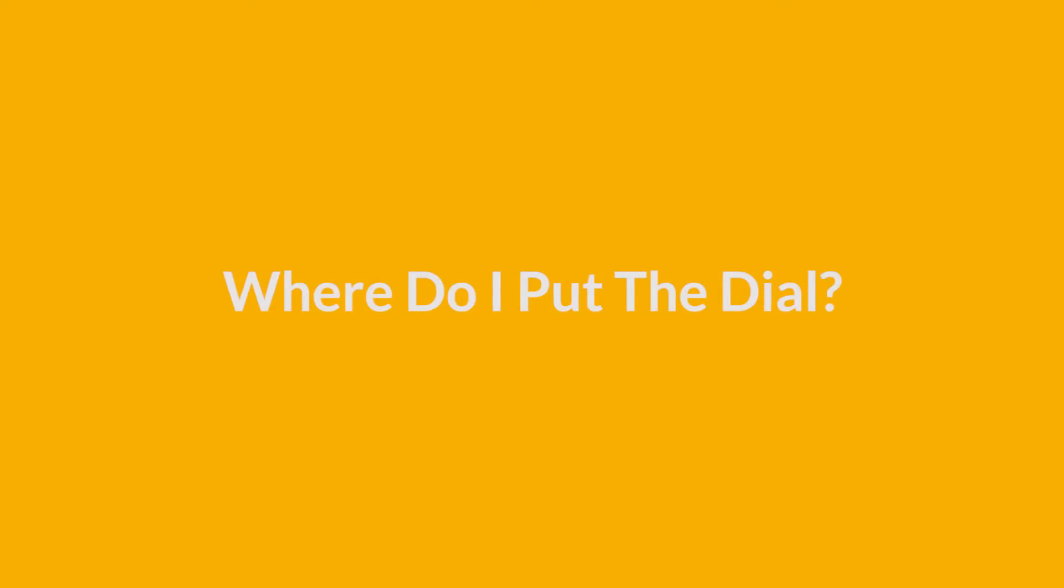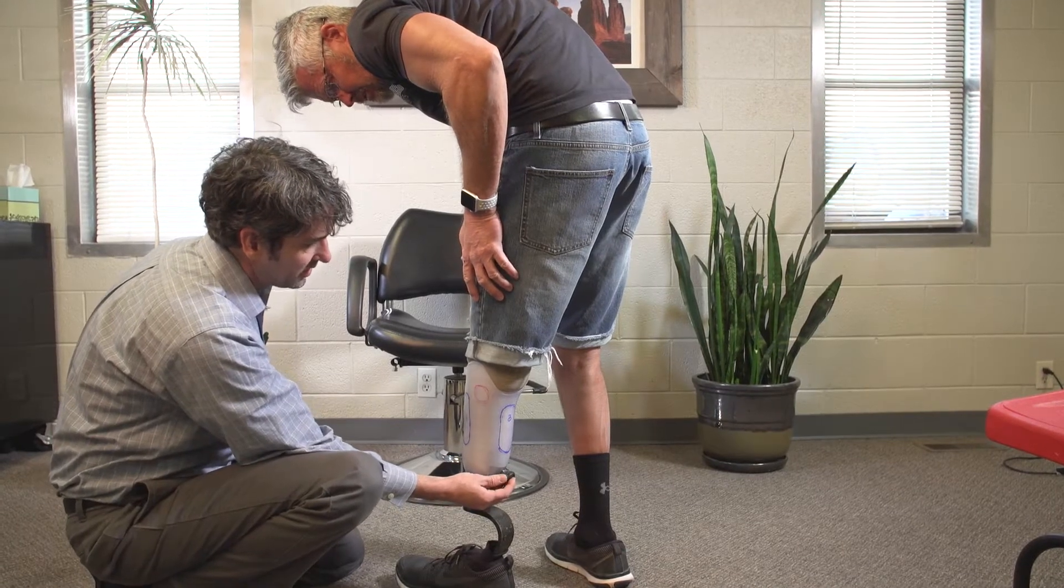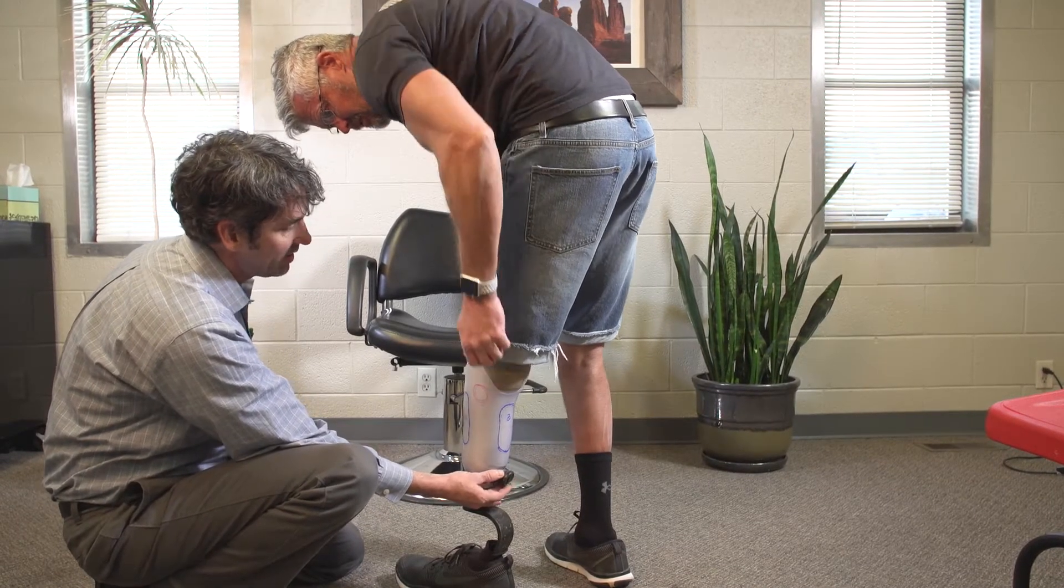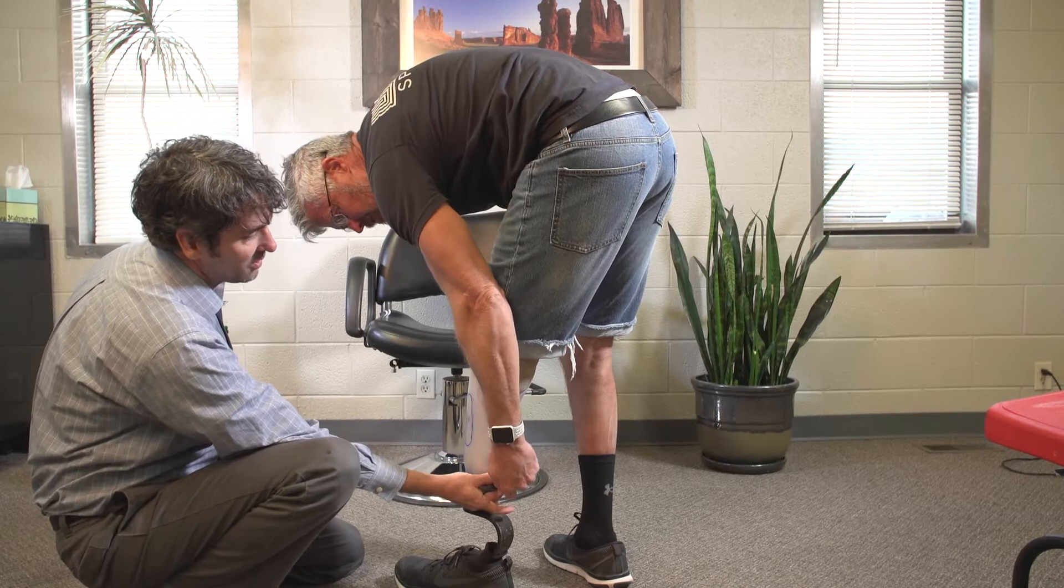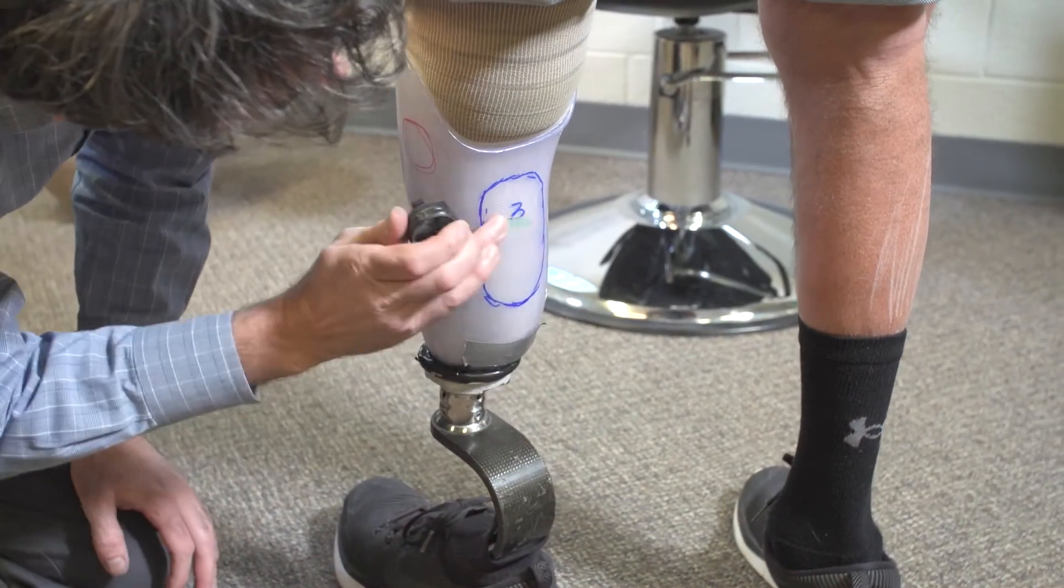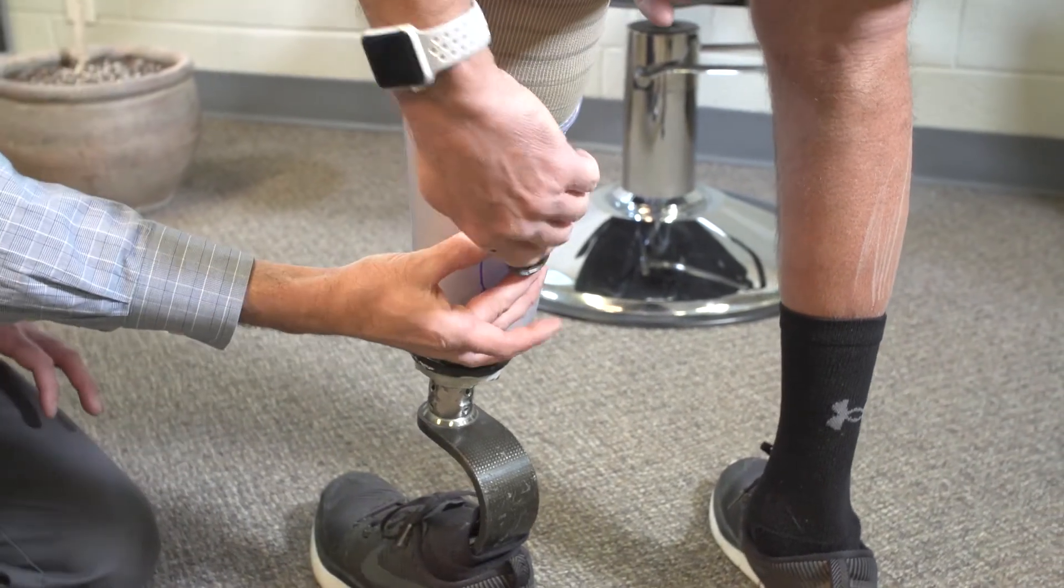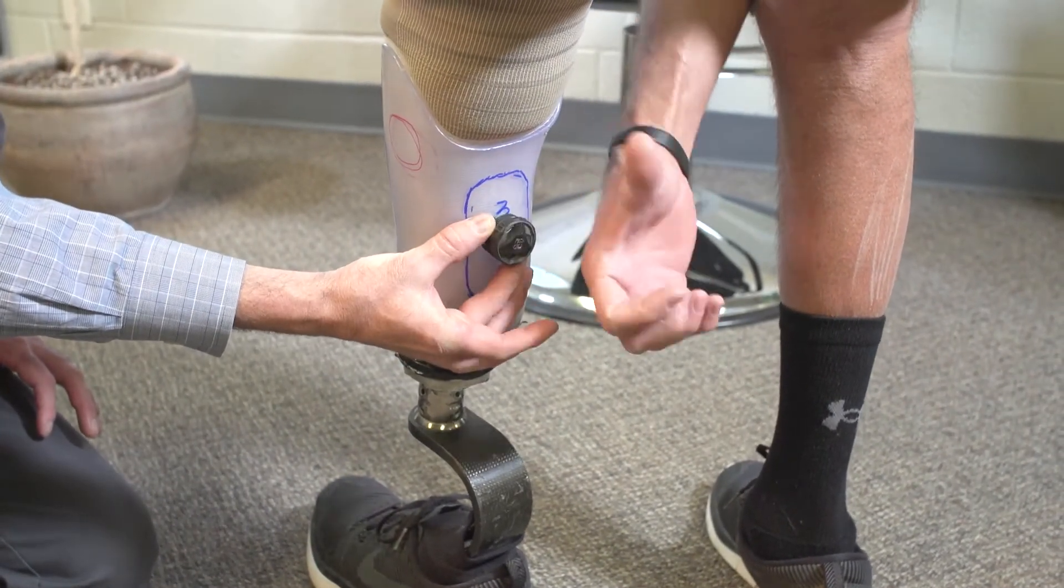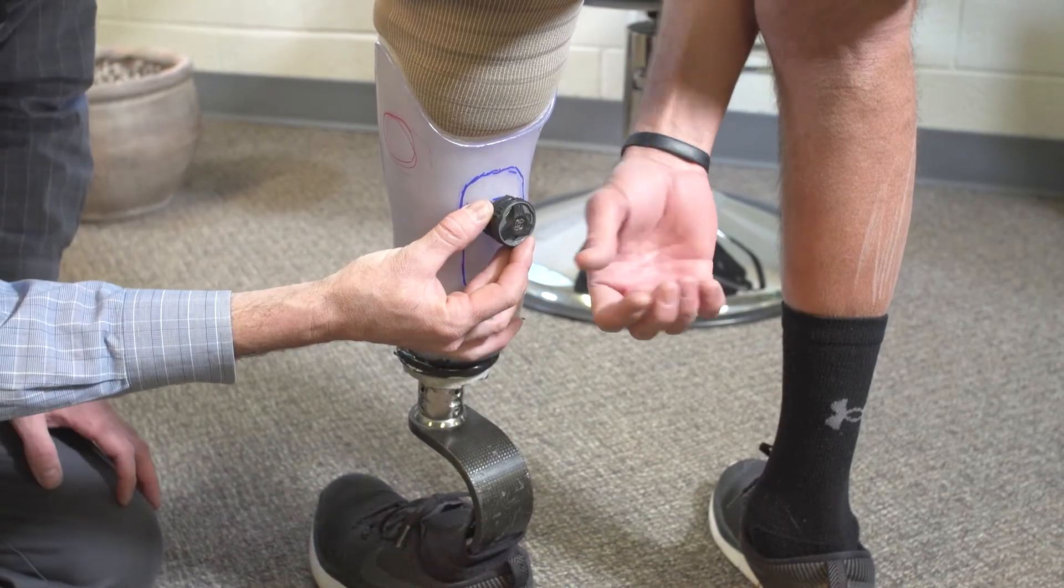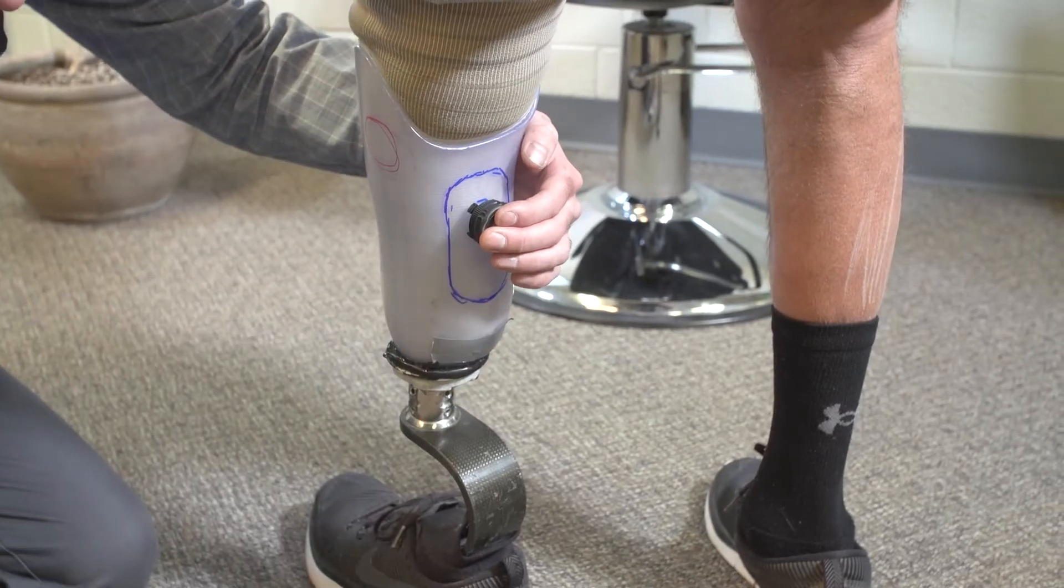Where do I put the dial? Ultimately, dial placement is up to your patient's preference, and it really can go almost anywhere. But for this course, we will put the dial on the posterior panel, along the top lacing pathway. Here, it's easy to access, even through clothing, and the gastroc area responds most efficiently to volume changes when adjusting.